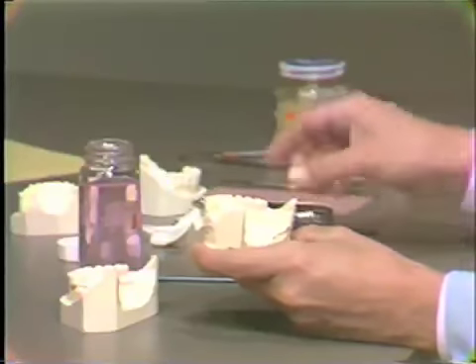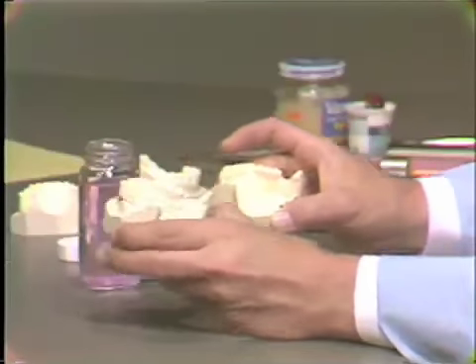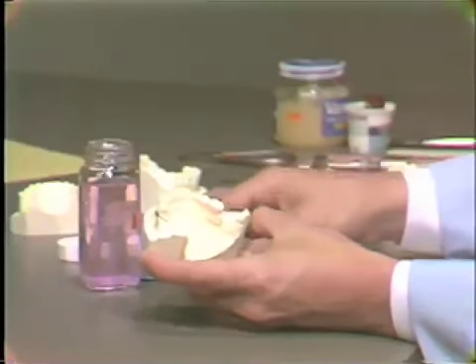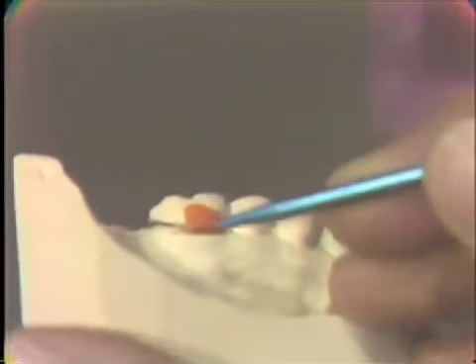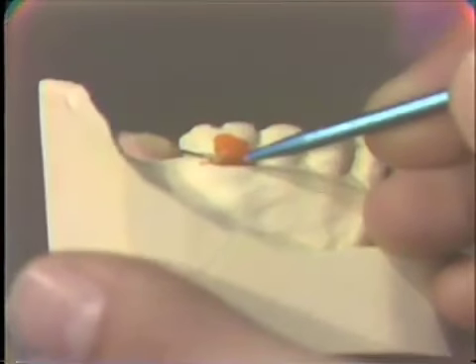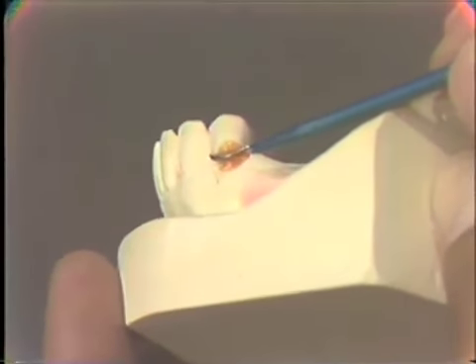Okay, now that can be drying from on the lingual side, and we would then place our wires in position. Now, the wires would be placed in position and tacked with a drop of sticky wax from the buccal surface. If we placed it on the lingual, we would interfere with our retention into the acrylic, since that's where we're going to place the softened acrylic. So we tack them from the buccal surfaces and hold them in position.